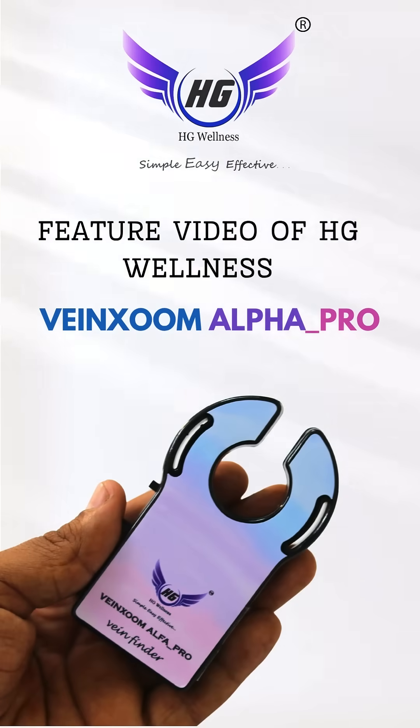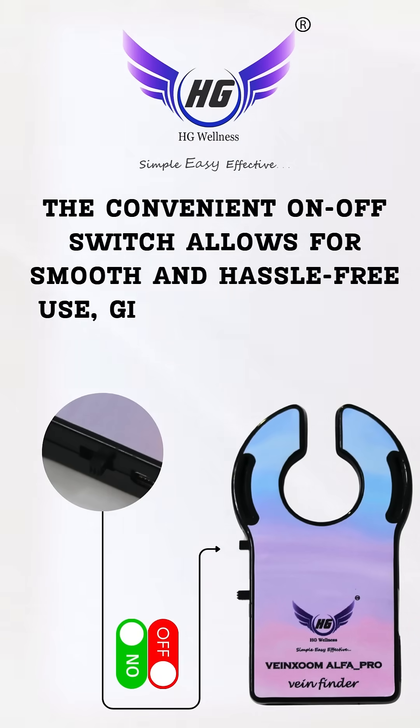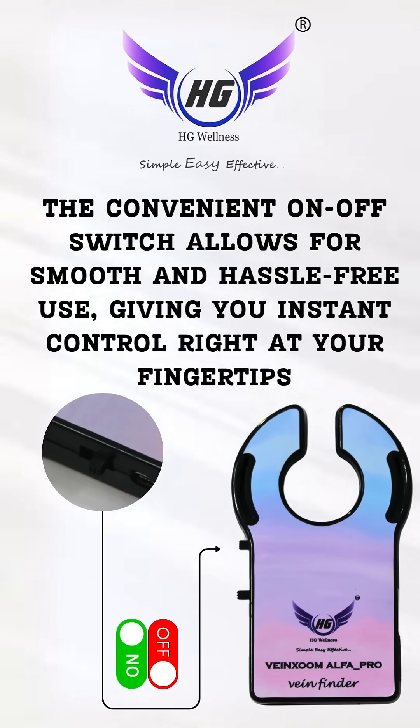Feature video of HG Wellness VeinXoom Alpha Pro. The convenient on-off switch allows for smooth and hassle-free use, giving you instant control right at your fingertips.